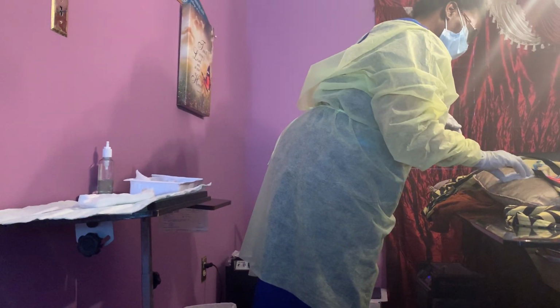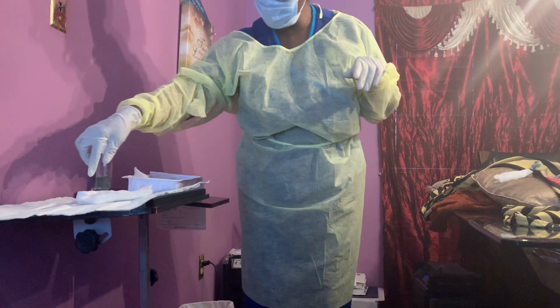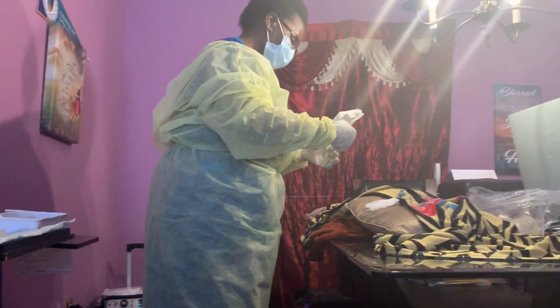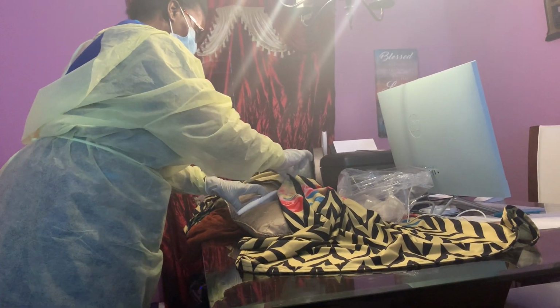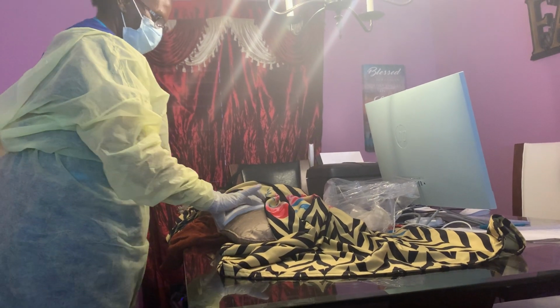And once that is done, now I'm gonna use my ABD pad. My ABD pad was within the sterile field, so I'm gonna pick it up, and then I'm gonna pass it on here and cover the wound with the ABD pad. So now the wound is dressed.